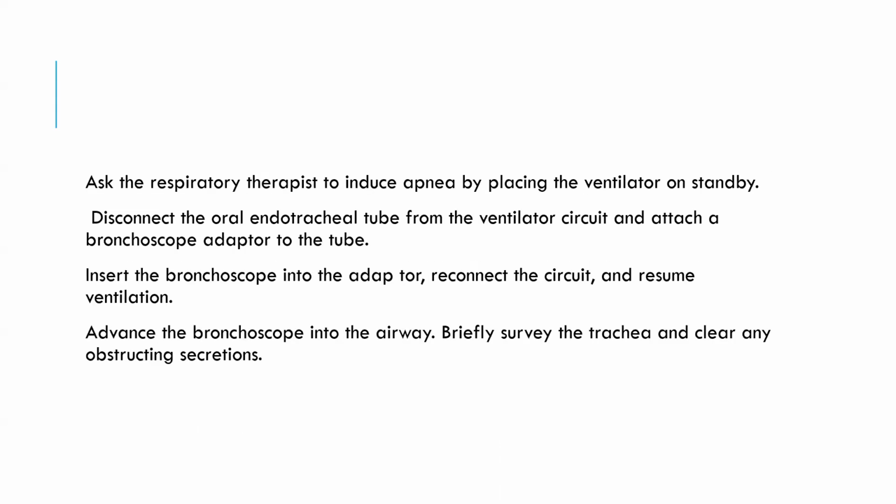Ask the respiratory therapist to induce apnea by placing the ventilator on standby. Then disconnect the oral endotracheal tube from the ventilator circuit and attach a bronchoscope adapter to the tube. Insert the bronchoscope into the adapter, reconnect the circuit and resume ventilation. Advance the bronchoscope into the airway, briefly survey the trachea and clear any obstructing secretions.